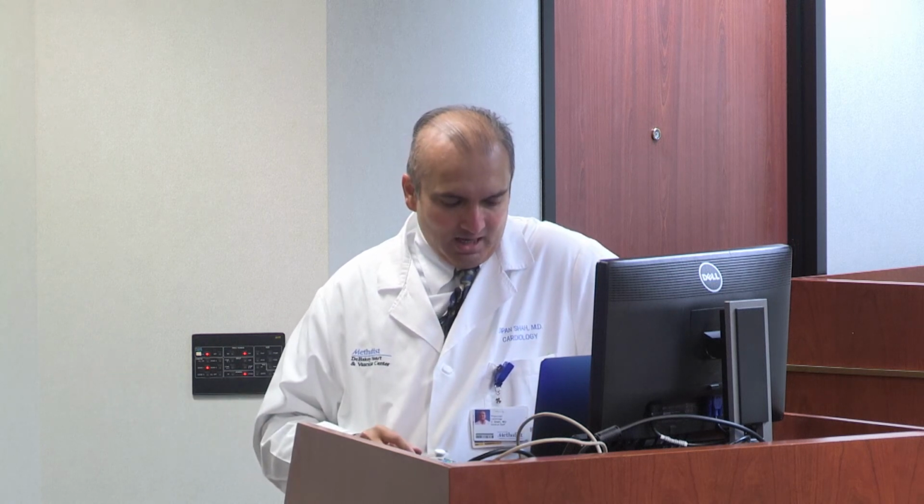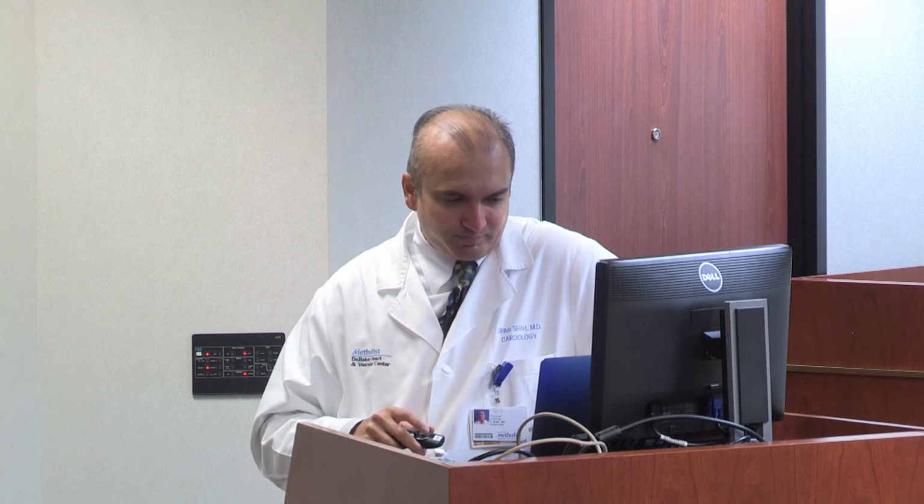So you don't want the cleaning crew coming in, you don't want your code team coming in to try to save the patient. The first thing you do, if there's a code inside the MRI scanner, is you get the patient out of the scanner, close the door, and then start doing CPR and your resuscitation. Okay, so those I think are basic important things that everyone needs to be aware of.